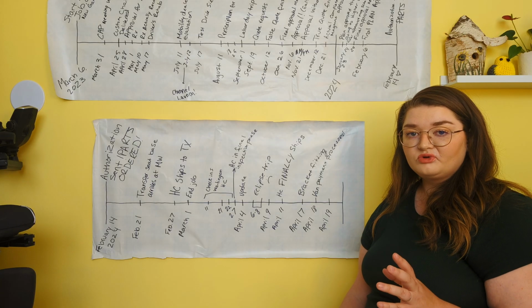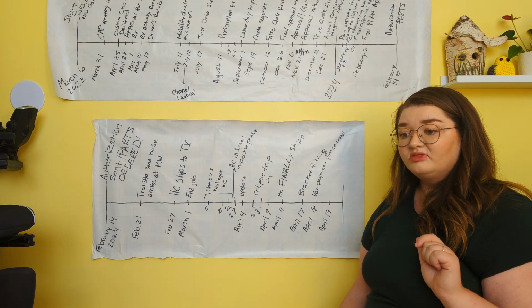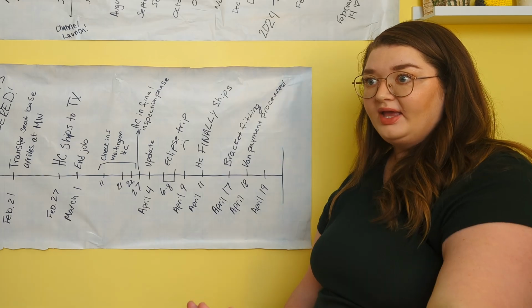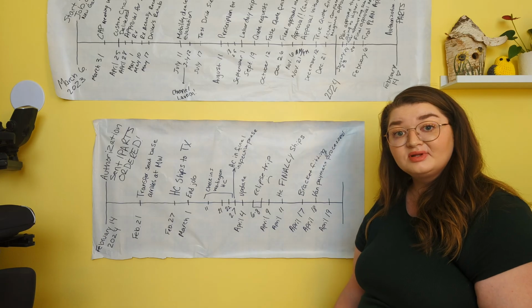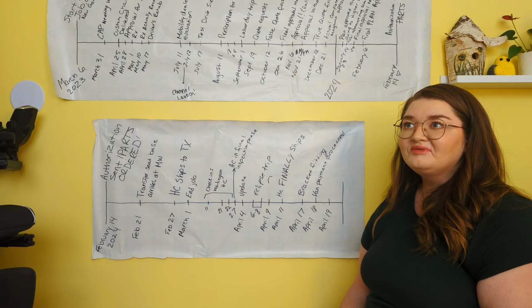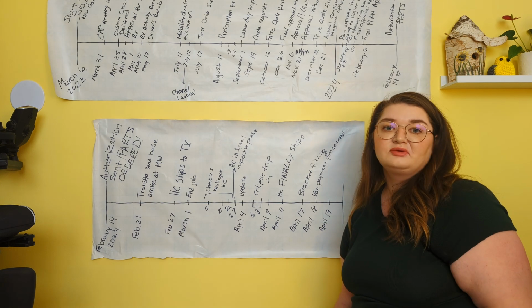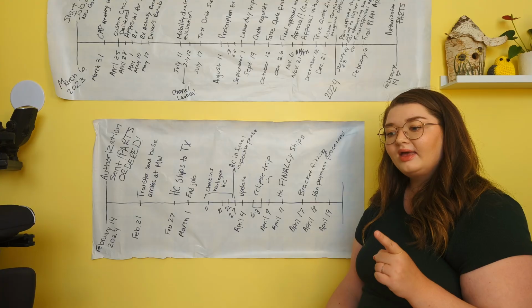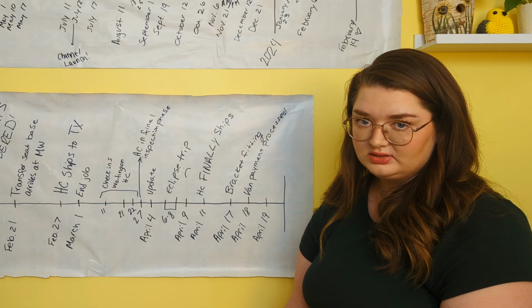Yeah, I know. Basically what he told me was wrong was that when the low effort braking module was active, it was just pumping the brakes all the way down and back out really, really fast. And it wouldn't stop. So that's obviously a problem if you want to use the hand controls. If the brakes are not functioning properly on your car, that's a problem. And so we went and it wasn't good. It's borked.